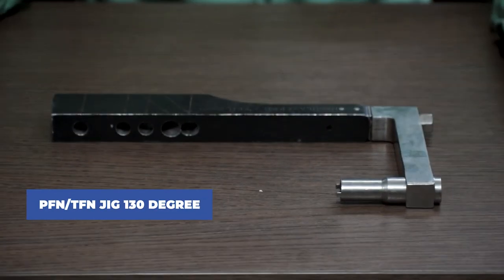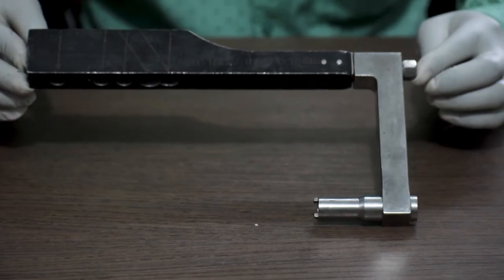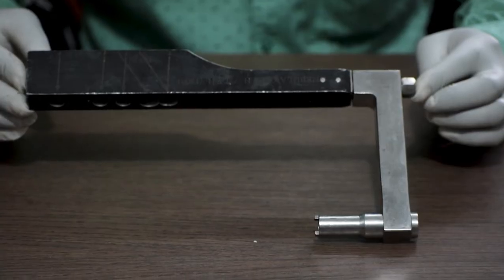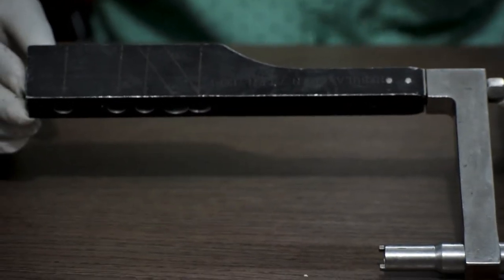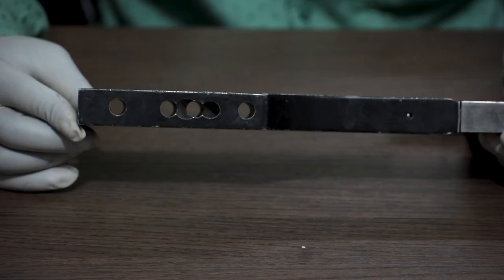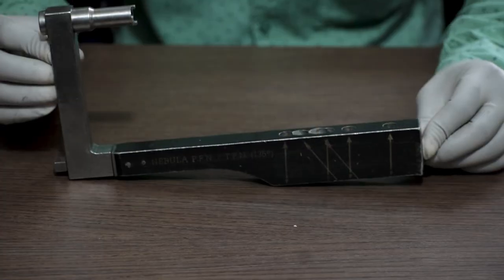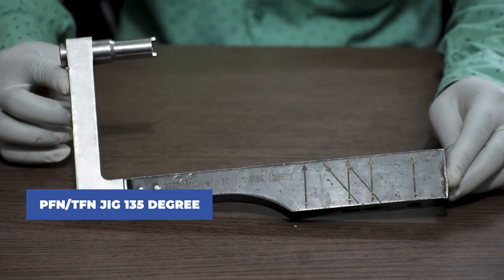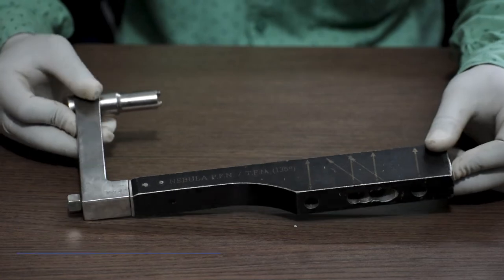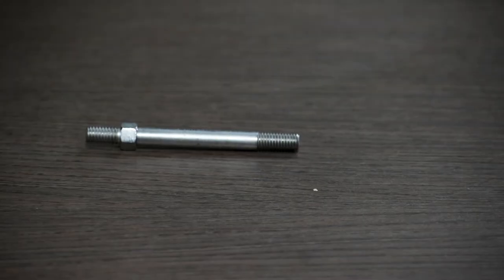This is a TFN PFN jig for the 130 degree PFN. Here you can see there are options for the interlocking bolt to be fixed in the nail. And this one is a TFN PFN jig for 135 degree PFN. Next, this is a conical bolt.